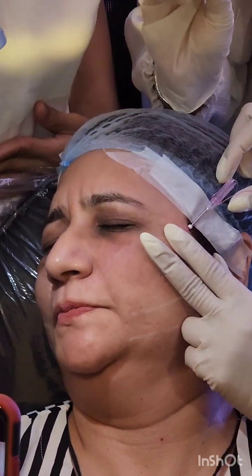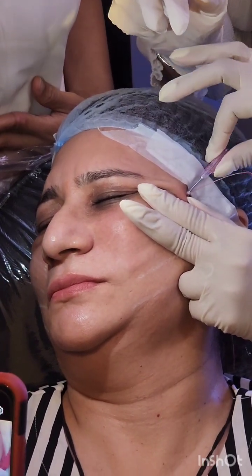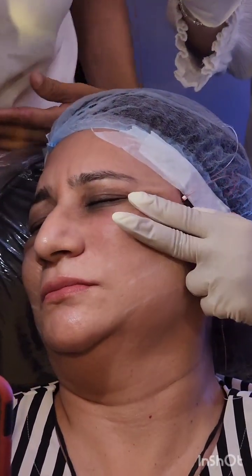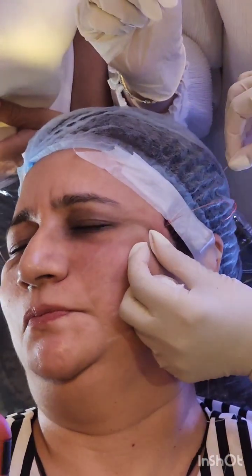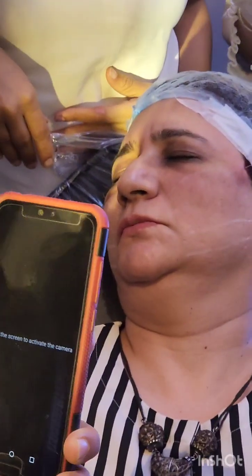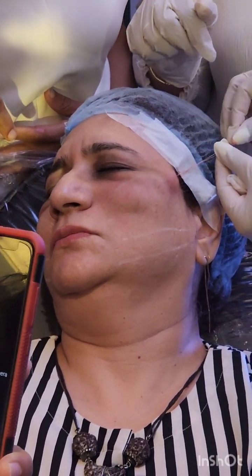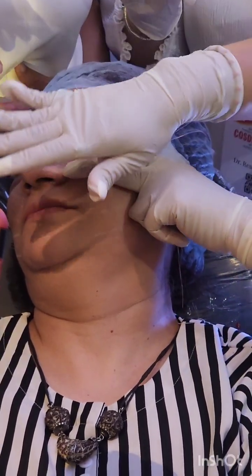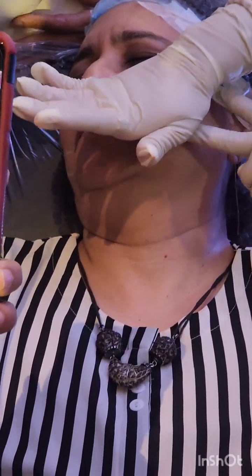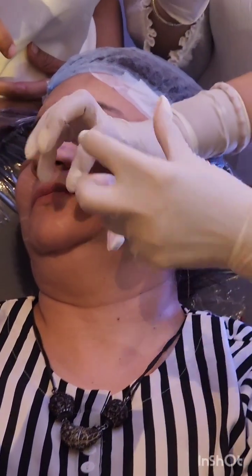Done, ma'am. Okay. Glide your skin over the needle itself and make it easier and then come out. Done? You okay? So it's actually very complicated procedure. If the patient does not have any scarring or something, it's not that. Needles, cannula smoothly goes. So by massaging this, actually you are incorporating the fat, subcutaneous fat, so it gets nice.